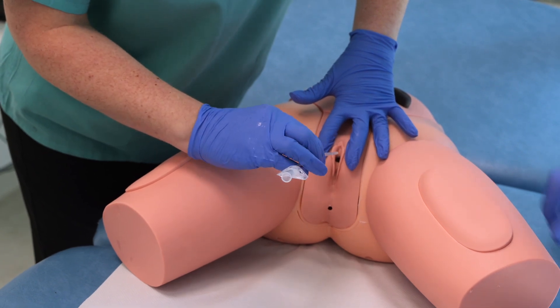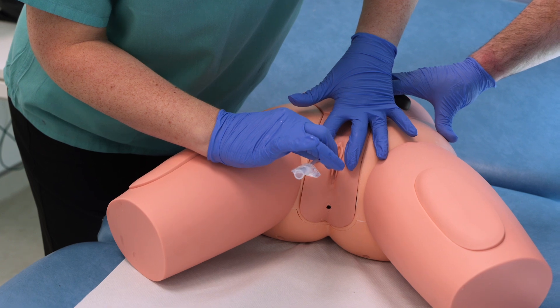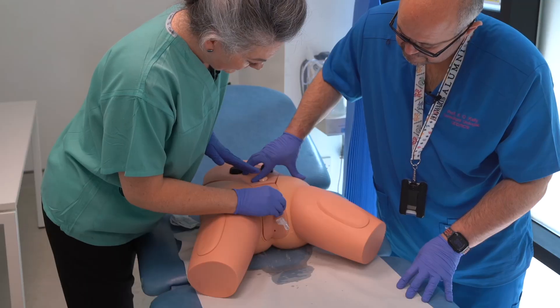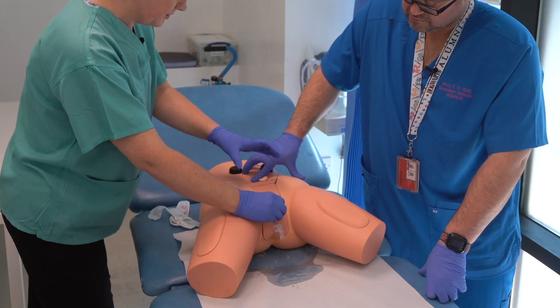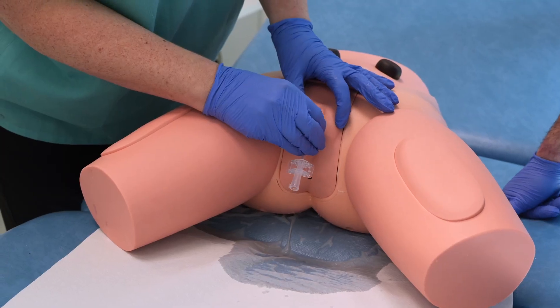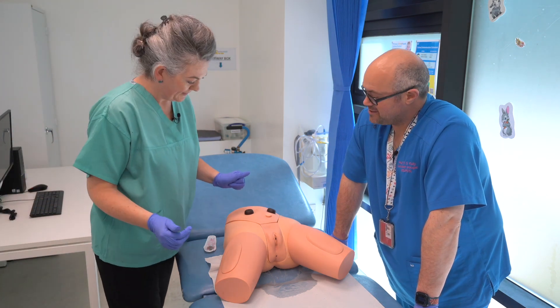Ask for a little cough to help locate the urethra. For positioning, ask them to bring their knees up and frog-leg them out to the sides. Find the urethra, go in — it's usually a shorter run for females — and hold the catheter in place until it's drained. Pressure on the abdomen, a cough, or sitting up with gravity helps fully empty the bladder. Once flow stops, slowly remove the catheter in case you get an extra little bit of flow, then remove and discard in your household bin.